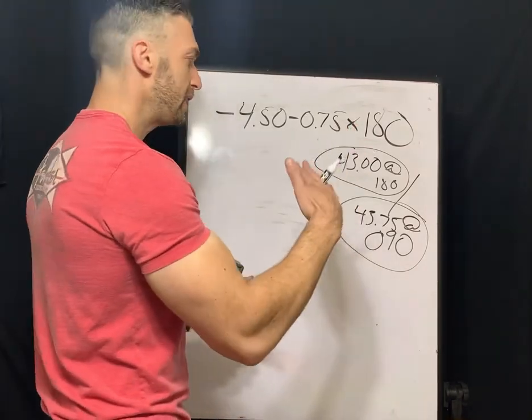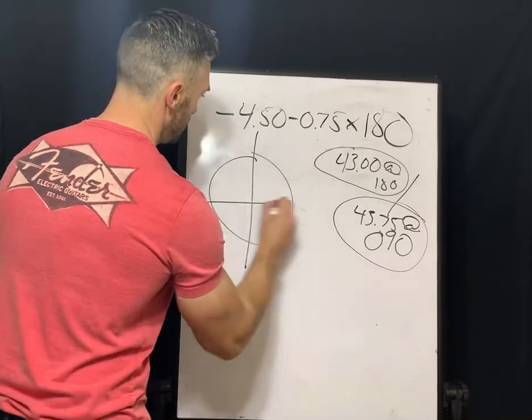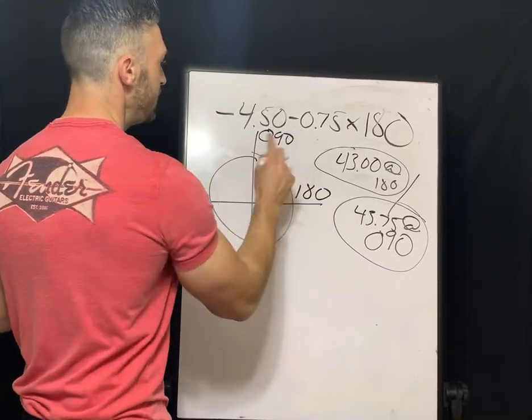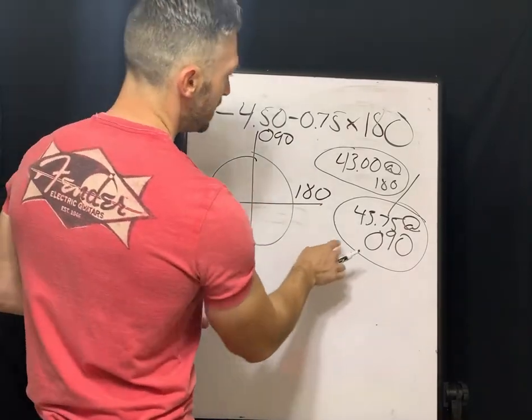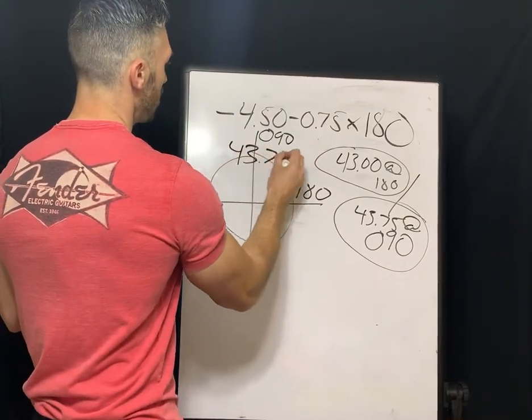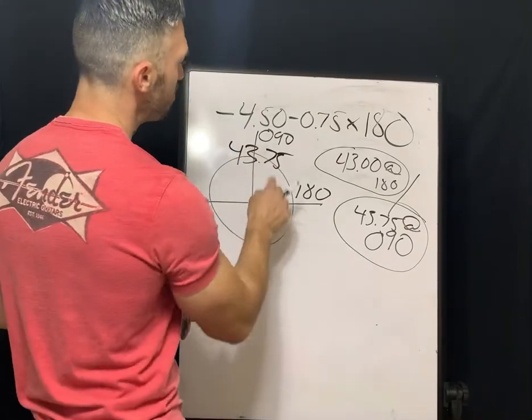Anywhere within 30 degrees of 90 degrees, if you have your meridians laid out, your 90 is your vertical, your 180 is your horizontal. So it's saying that we have a steeper power at the 43.75. That's our corneal dioptric strength, or our K reading, on the 90. So that's steeper on the 90.